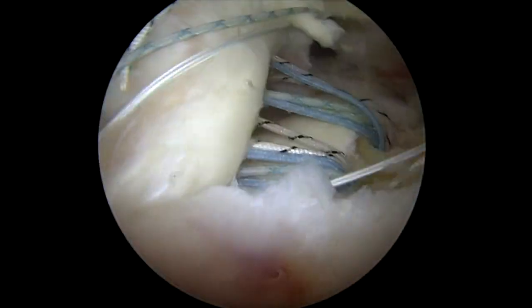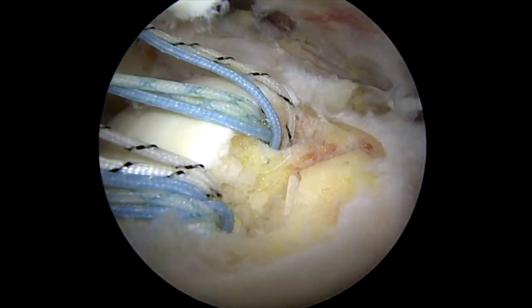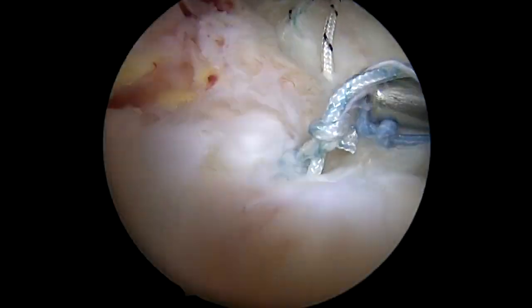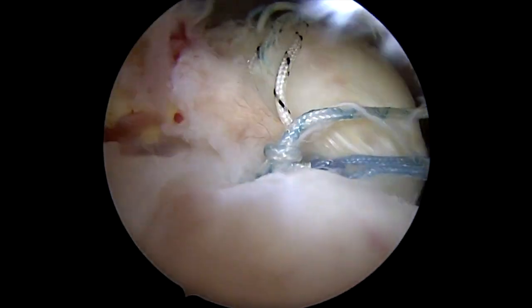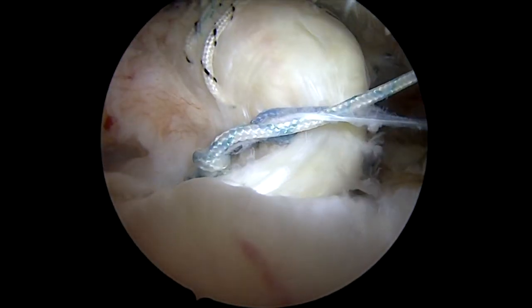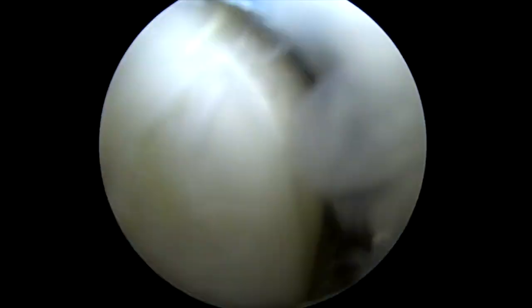That's all the sutures passed now, and you can see that they're completely evenly spread throughout. Now I'm going to grasp the sutures from back to front out the lateral cannula — passing from front to back, tying from back to front. And you can see as I pull those, it brings the tendon nicely over. I don't think it matters what knot you use; I tend to use stacked half hitches because I think they're more controlled. We'll tie those one by one and usually cut one of these each so we can bring one suture strand from each into our lateral row anchor. This allows me to use just one anchor laterally instead of two, which saves a fair amount of money for the patient.